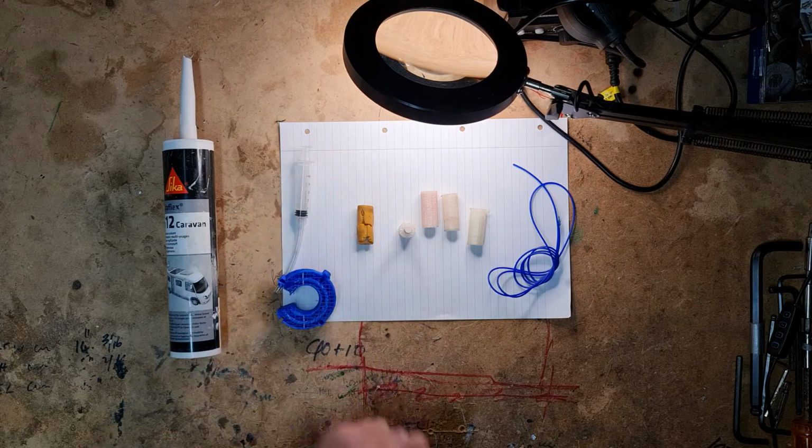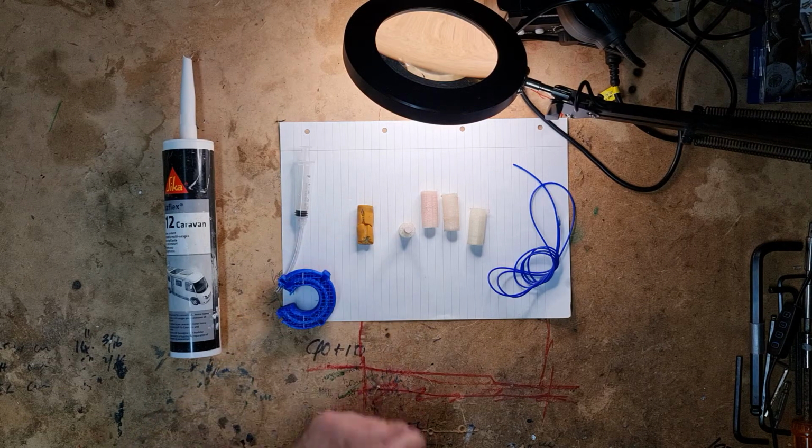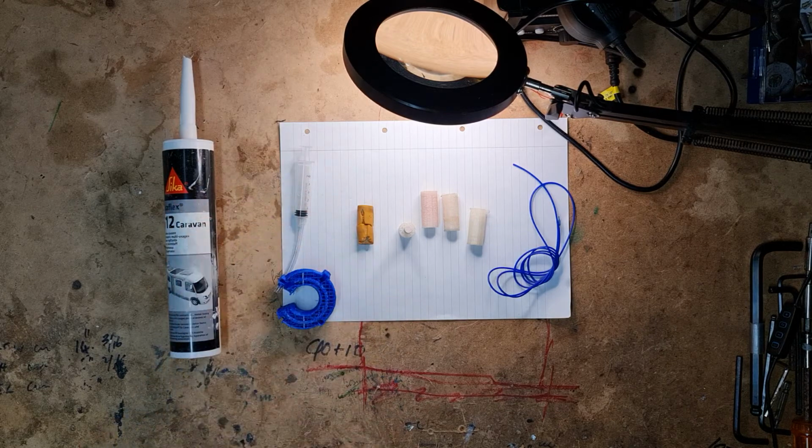So this particular unit, I bought this off eBay. Somebody put some motor oil in. If I remember rightly, it was mineral oil by the smell of it, and it actually attacked the material that this unit's made out of, and basically made it go mushy, and I had to get it out with a screwdriver because it was stuck in the unit. So we have a problem here. This is made from some kind of resin, mainly I think for longevity, because they don't want too many service intervals with this type of thing. So very simple piece of technology.